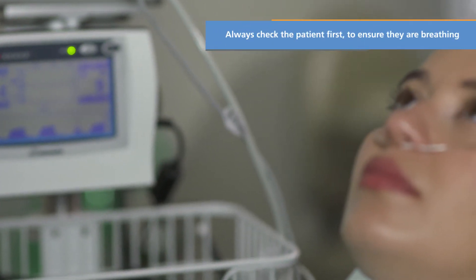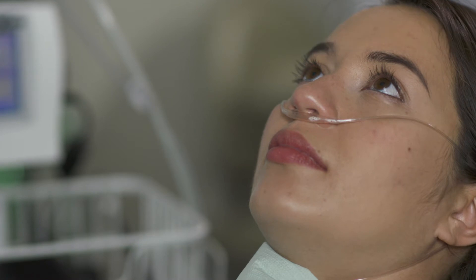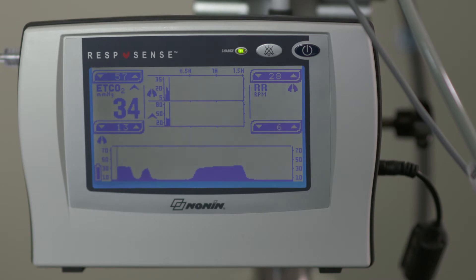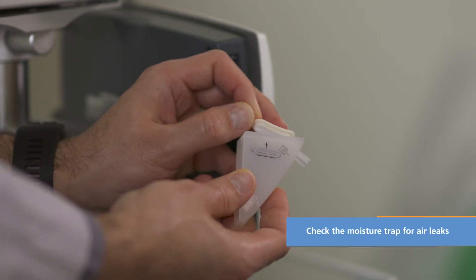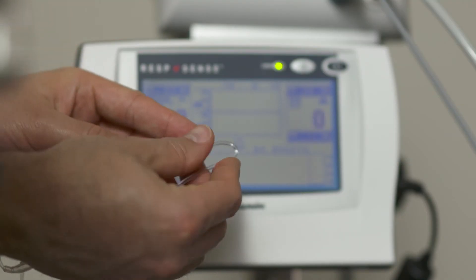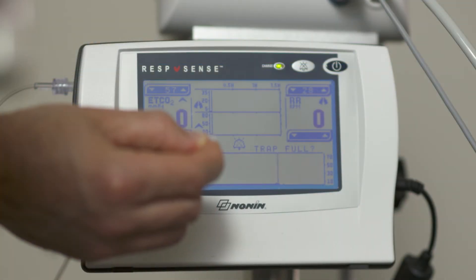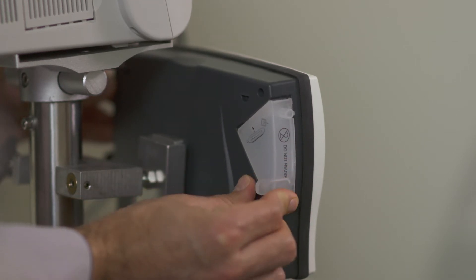Always check the patient first to ensure they are breathing adequately and the cannula is properly positioned on the face. If the patient is mouth breathing, there may not be sufficient airflow detected through the nasal prongs. Check the moisture trap for a secure insertion with no air leaks. Briefly pinching off the cannula should result in an occlusion message. If you can't occlude the cannula, the trap and filter may need to be reinserted or replaced.